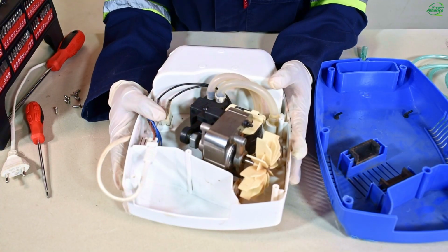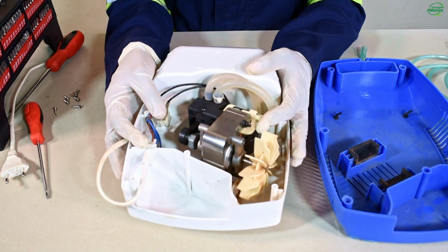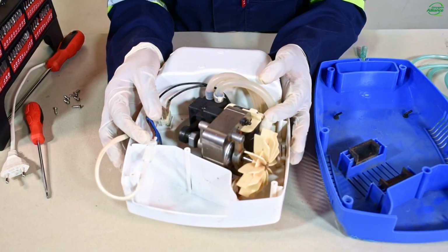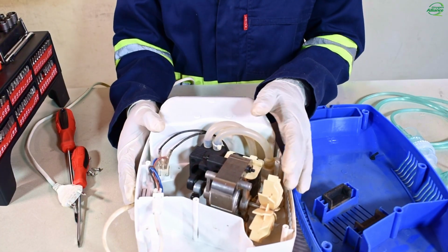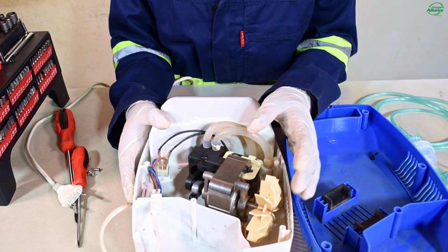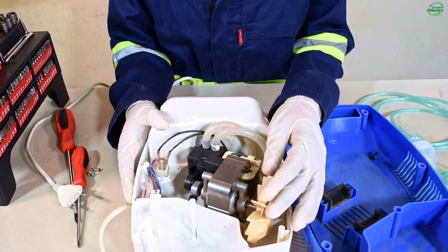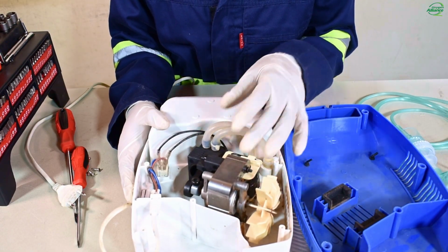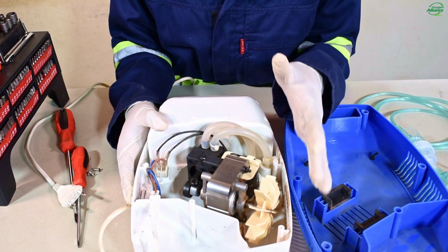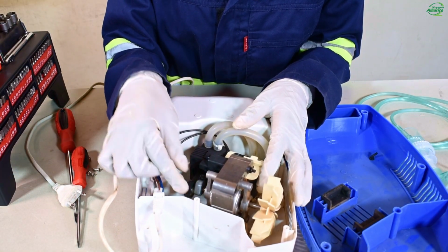A failing compressor unit can be identified by the following symptoms: weak or no airflow, abnormal noise, or overheating. Mostly, a weak or no airflow is caused by a clogged pump. For this reason, it is recommended to clean the unit. When there is overheating, please check the integrity of the fan as well as the motor windings. An abnormal noise is often caused by damaged gaskets, misalignment of the piston, or a clogged motor.